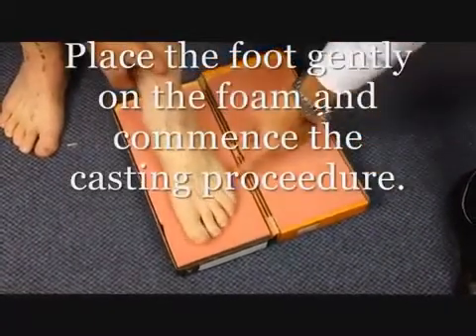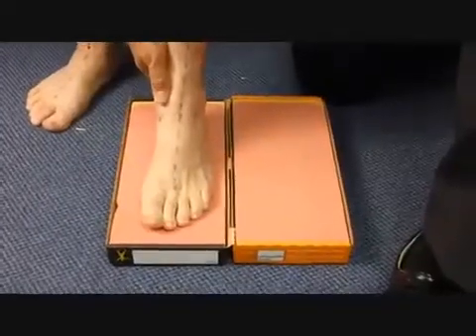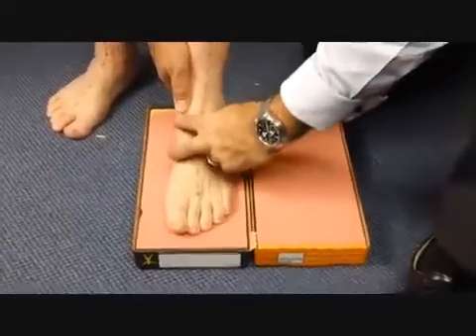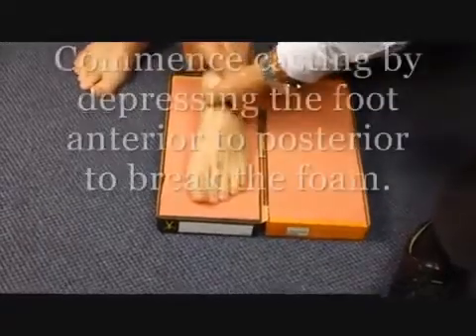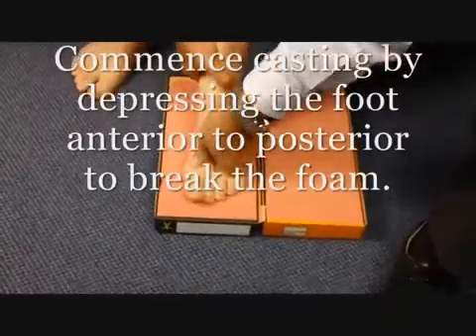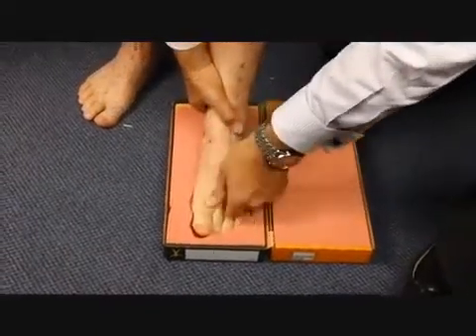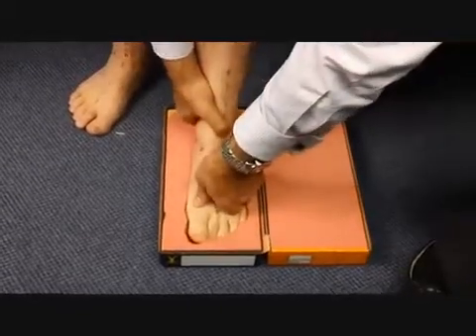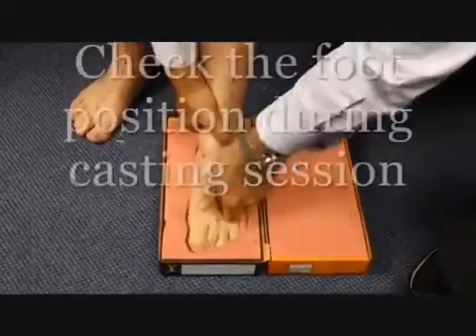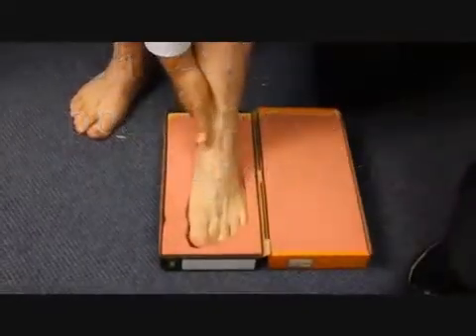Gently place the foot on the foam box. Use the anterior line to maintain neutral. Commence casting by depressing the foot anterior to posterior to break the foam, then depress the foot to the base of the foam. While casting, check the position of the foot and maintain the anterior line in the ideal position.